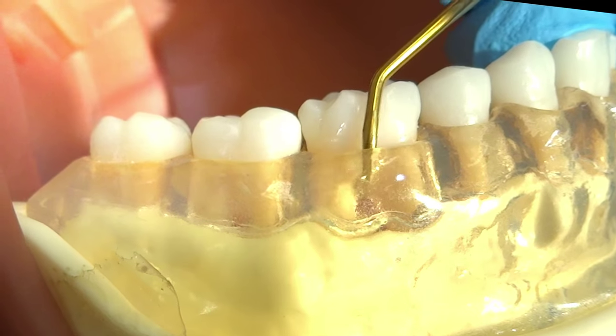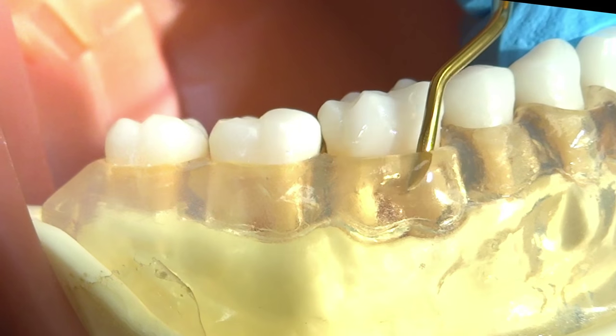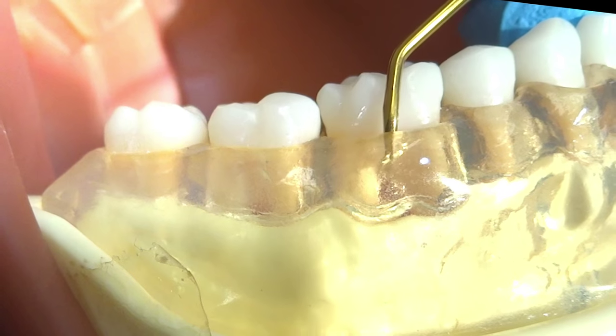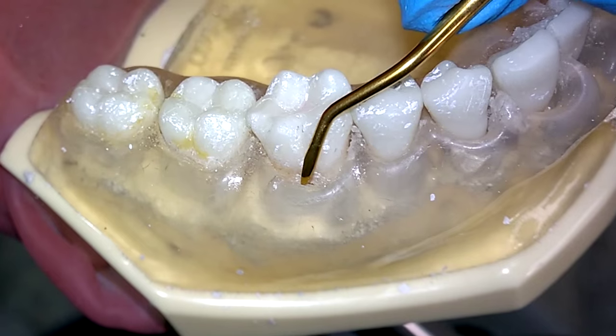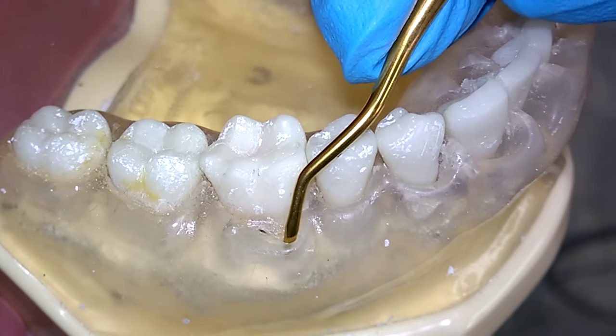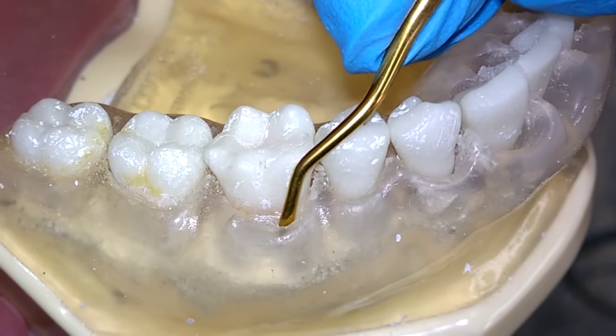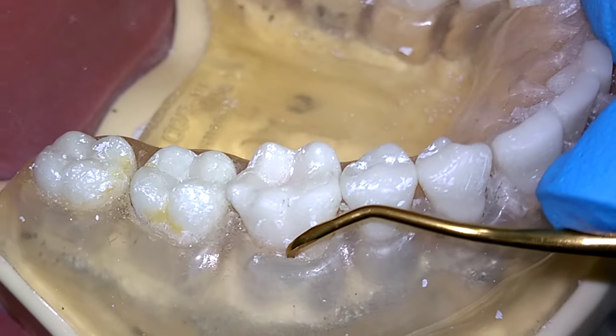Cleaning furcations with the double Gracie is a breeze. No longer do we have to deal with the confusing sequence of the mesial of the distal root with the 11-12 or the distal of the mesial root with the 13-14. From another view, you can see that the double Gracie easily adapts in furcations. A horizontal stroke can also be used to easily remove calculus in furcations.